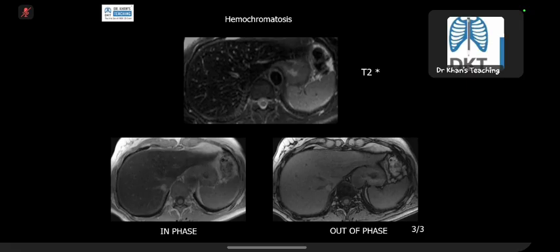There are two things for us to give you. One is diagnosis: is there iron inside? And then is quantification. In our hospital, we did not have the software to measure the quantification. Only in the last 2, 3 months we have acquired it. So now it's simple. The software tells you, because the gastroenterologists want to know that if it is iron, what is the quantity, and there is a factor. So we can do it.